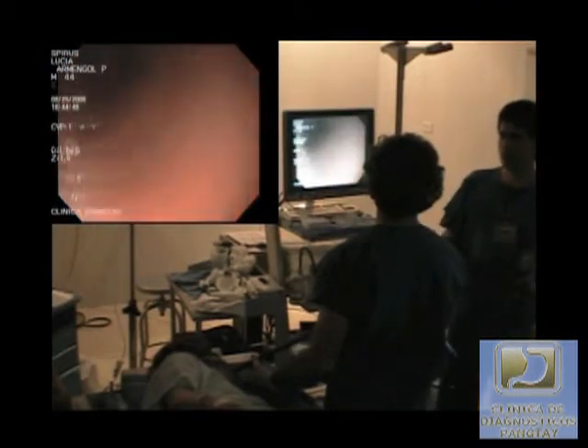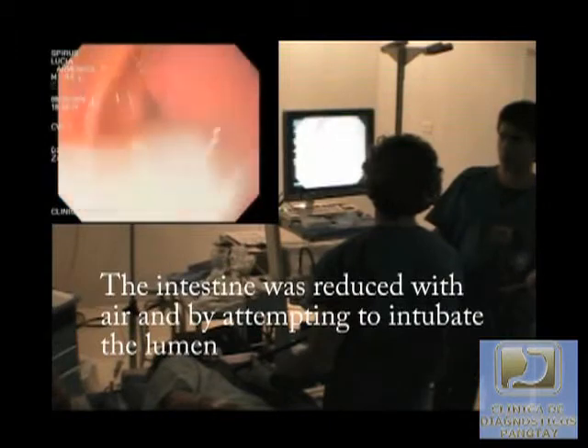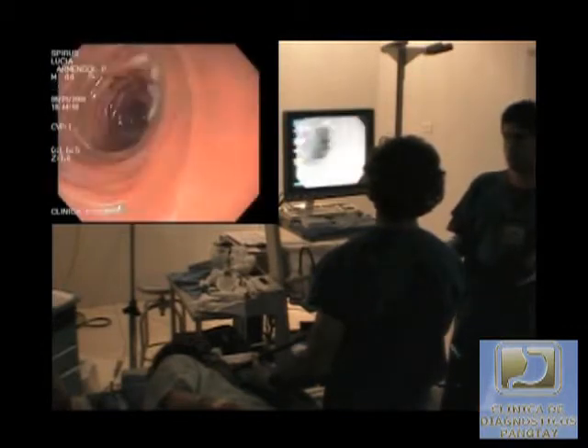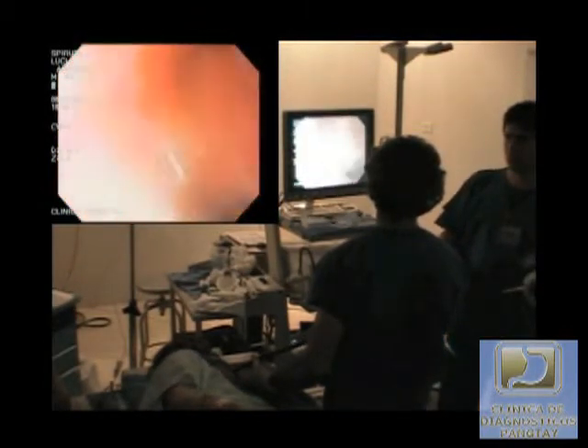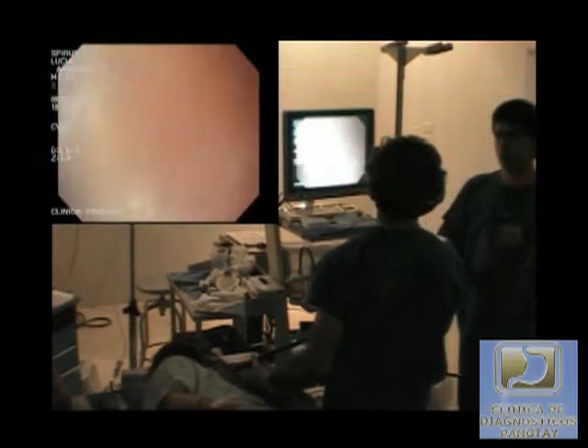In this particular case, a jejunal intussusception was identified during withdrawal. It was resolved with the insertion of air into the lumen, then followed with a water injection. As you can see, the intussusception was reduced rather nicely, and the patient did not experience any further complications as a result of this procedure.